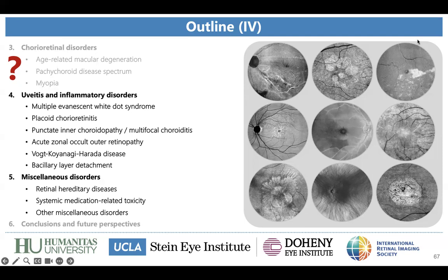And we followed these patients, and we noticed that these hypertransmission defects closed after the resolution. Can you add something on this point? Do you know something to tell us? I think she is preparing this paper, and I don't know if you have any comments.